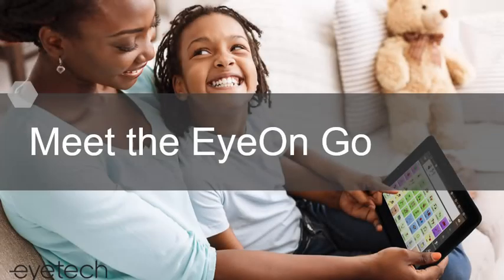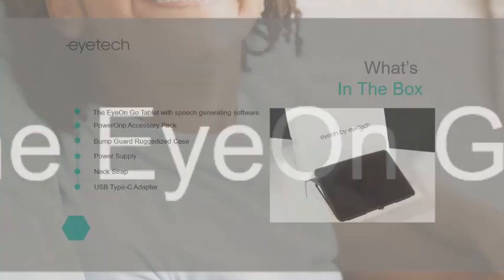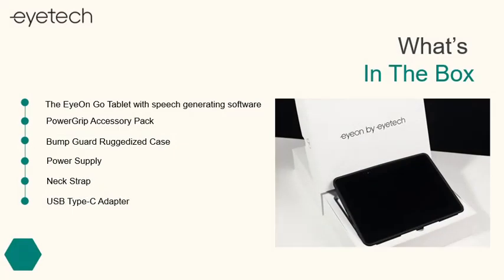Introducing the EyeOn Go, your voice anywhere. When you receive the EyeOn Go speech generating device, you'll have everything needed to get started right away.